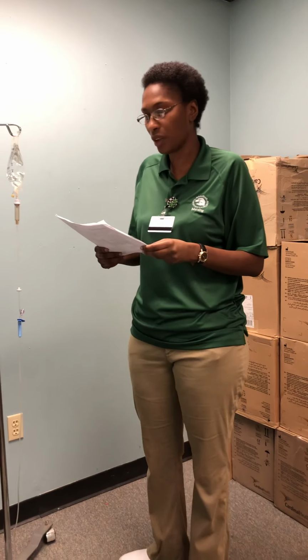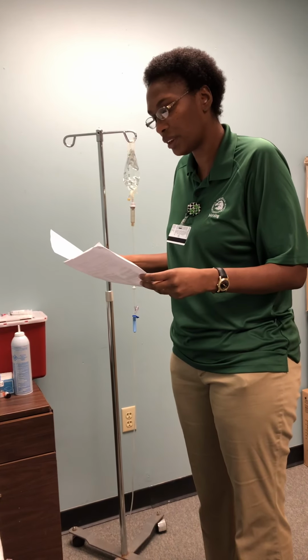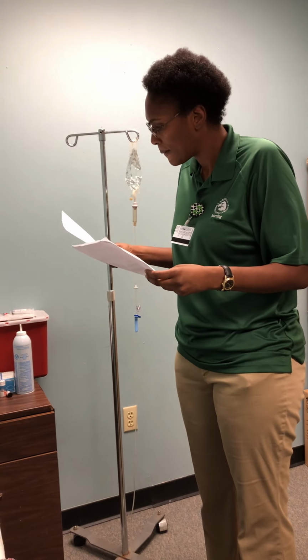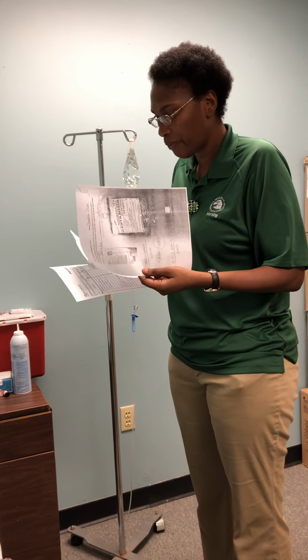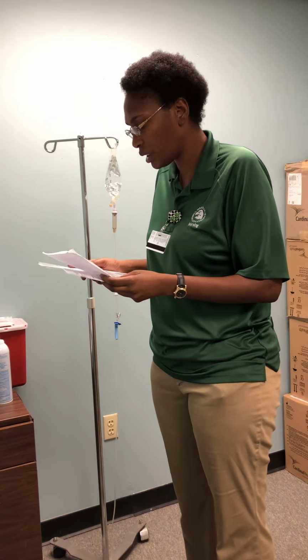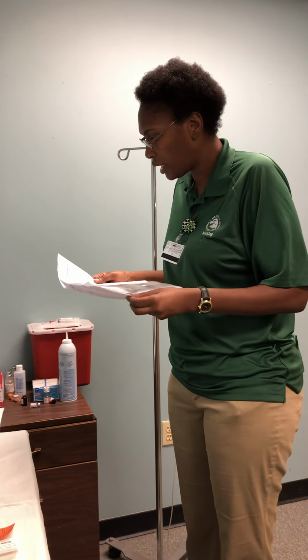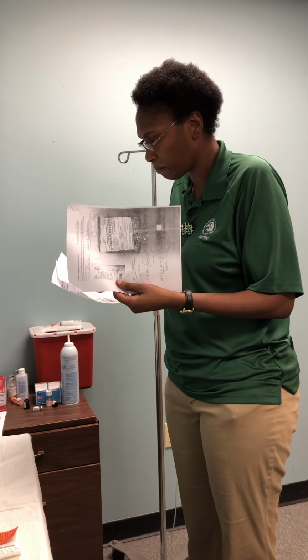Okay, I received my doctor's orders, and I'm going to check them with my MAR. The medication the doctor ordered is going to be gentamicin 60 milligrams IV piggyback every 12 hours, and it's on the MAR. And I'm also going to be giving furosemide 30 milligrams IV push. It's on the MAR. I'm going to be giving the gentamicin. The rate is going to be 17 drops per minute. And the furosemide is going to be given over 1 to 2 minutes.